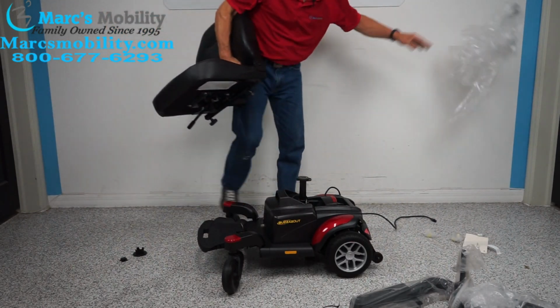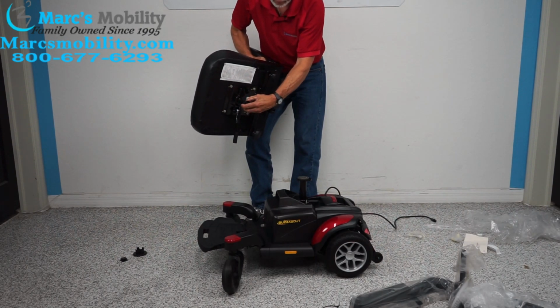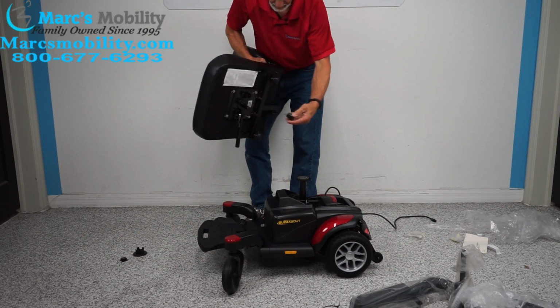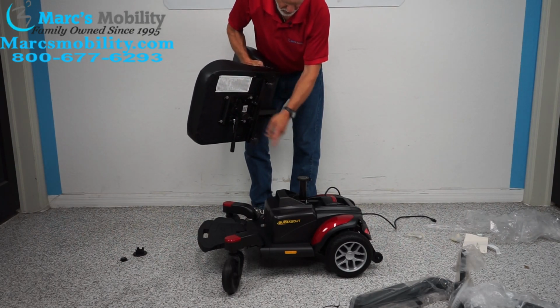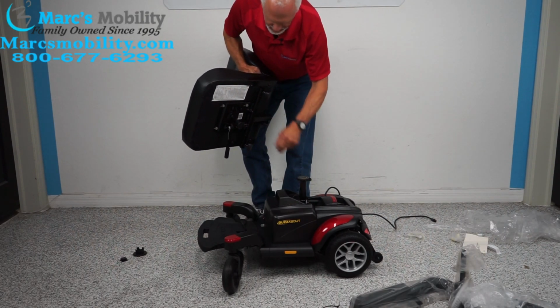There we go. When you put the seat on, if you notice under the seat, there's a little rubber tab. You need to take that off, okay? That's a protection tab. So take this tab off the pole because the pole has to go in here. Whoop. There we go. Wow, it's really tight in there.